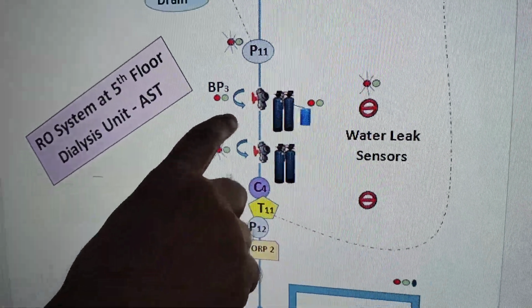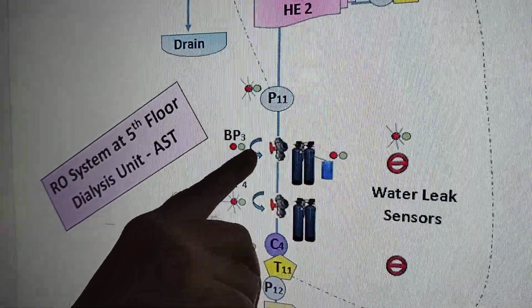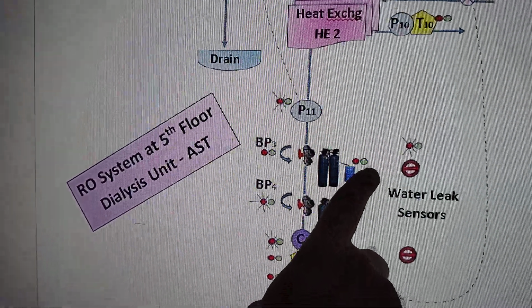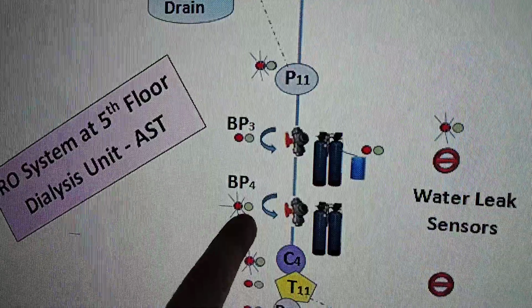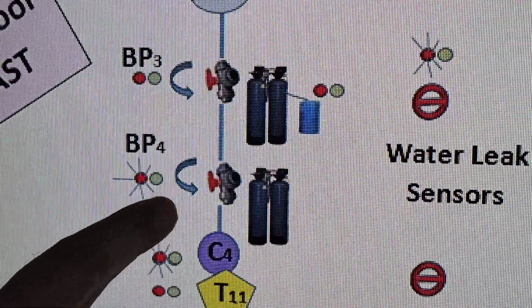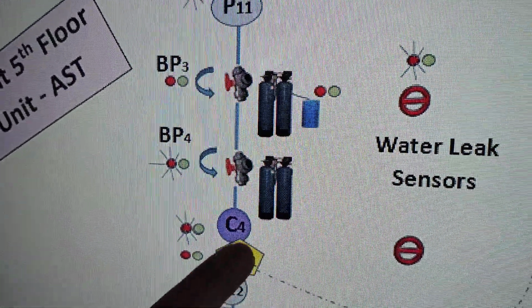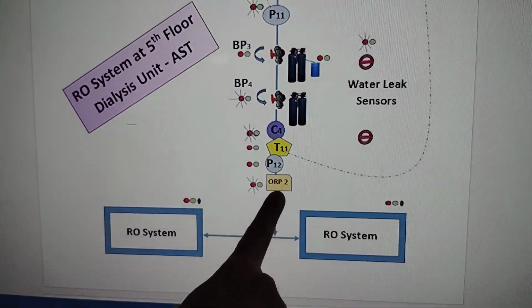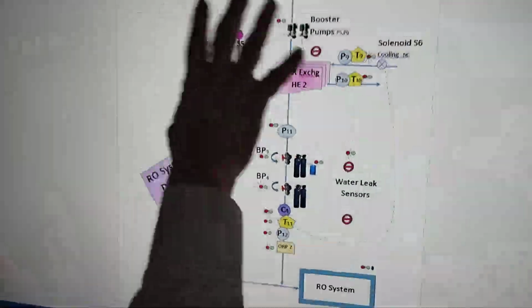If the softener is having a bypass stage, it should give a red indication. If it is working normally, it will give a green indication. Brine tank also, if the level is okay, then it has to give a green indication. Same way, if the carbon filter is in a bypass, this condition should not be there actually. It should give an alarm and indication as well, red light and alarm, and if it is working normally, it will be green. And then conductivity, temperature, pressure, and the ORP, the chlorine level, are being checked over here, and the water is given to the RO system. So this is how the whole system works.